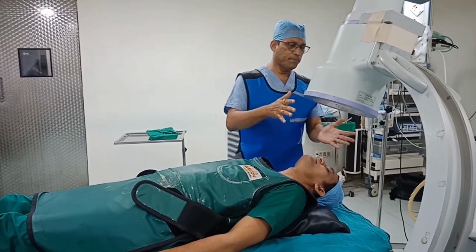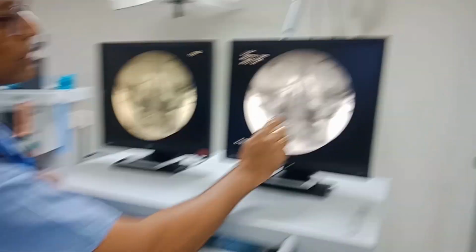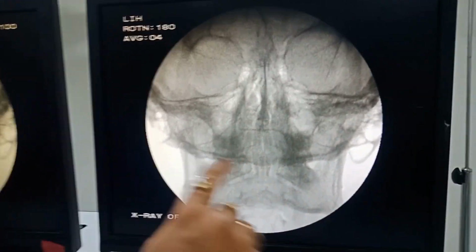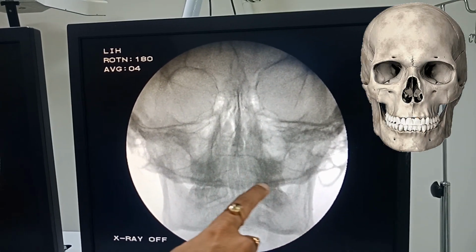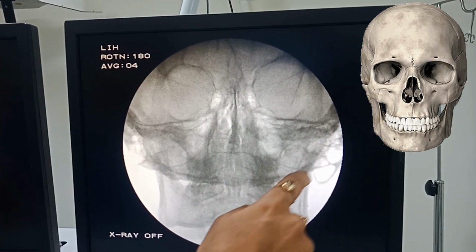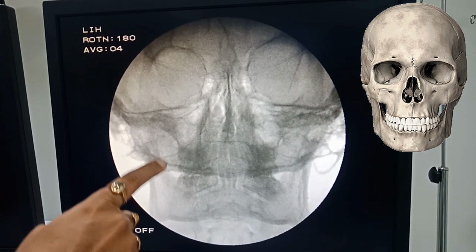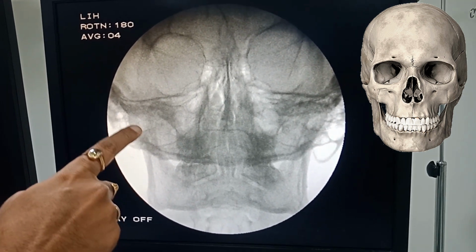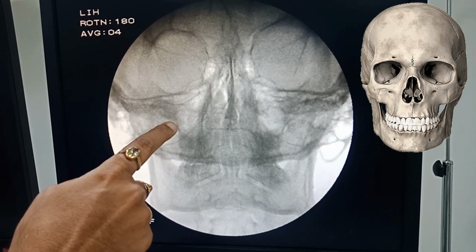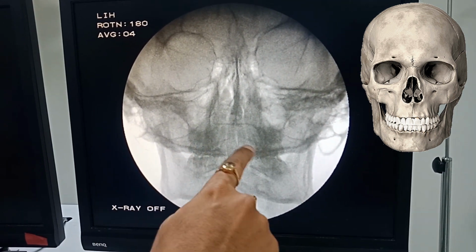So once we see the AP, now we come here. What we are watching here, this is the mandible. This is the lower border of the occiput. Here is the maxilla. This is the anterior border of the ramus. Here you can see the notch, coronoid process, condylar process. Lateral border of the maxilla is the ramus of the mandible. So this is the AP view.